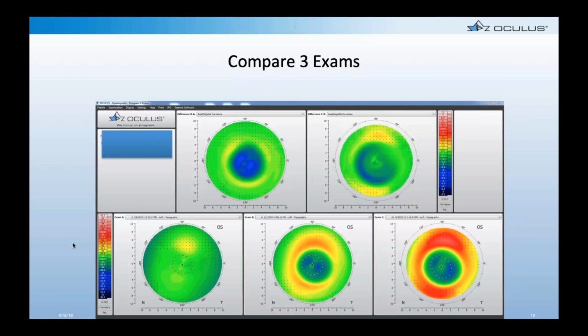So it's kind of fun to look at what happens over time. We have a lot of good initial central treatment, and then over time, we don't get any more central treatment necessarily, but we get more treatment just outside of that, expanding our treatment zone, and more of that plus power being developed as well, as we can see as that yellow ring is even brighter yellow and starting to orange.